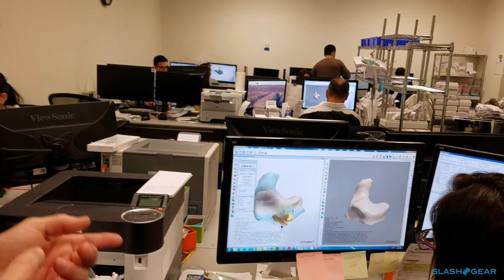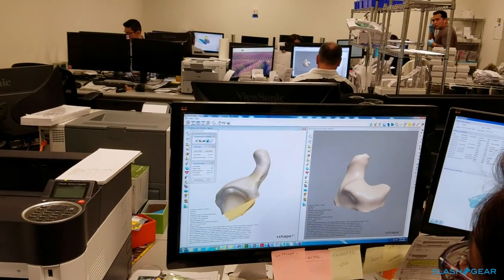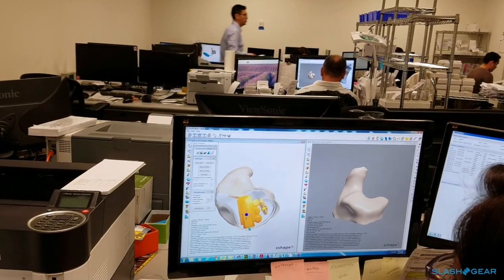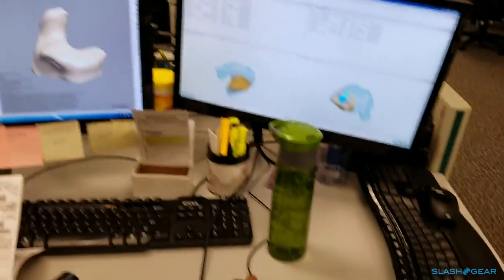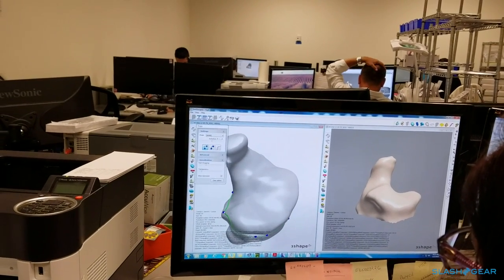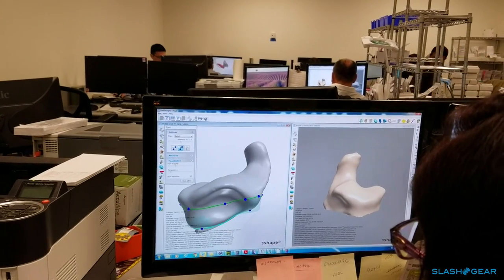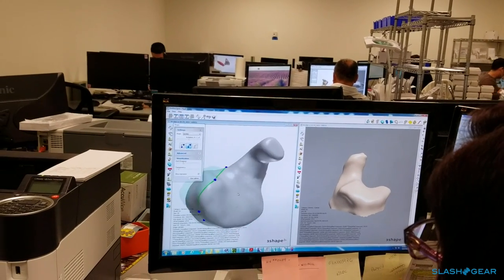No ears are the same person to person or left to right, so everyone is a new experience for her to model. We actually use three shape — it's pretty common in the industry. All of our folks have been trained; it's a dual mouse operation. We've been doing this for about two years in this fashion. What she's doing now is deciding the cut line — how far the hearing aid will stick out of the ear and where the faceplate will rest.